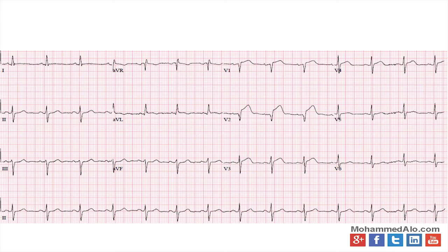This could be a residual ST elevation. This could be a patient that's always had ST elevations. It looks a little more than 3. Just by eyeballing it, looks about 4. 4 is not typically normal. Some patients have an acute MI and their ST segments never go back to normal. Does not mean they have an LV aneurysm. A lot of people think that that means you have an LV aneurysm. That's not been proven to be the case.